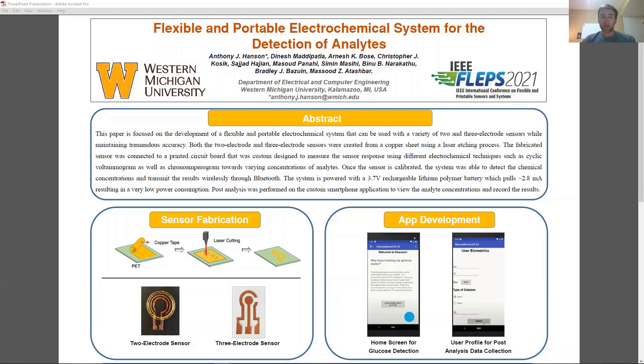For this project, a two-electrode and three-electrode sensor were designed and fabricated. This sensor is made from copper tape on a PET substrate. A precise 40-watt fiber laser from Universal Laser Systems was used to cut the design into the copper tape. After this was done, tweezers were used to remove the excess copper tape.